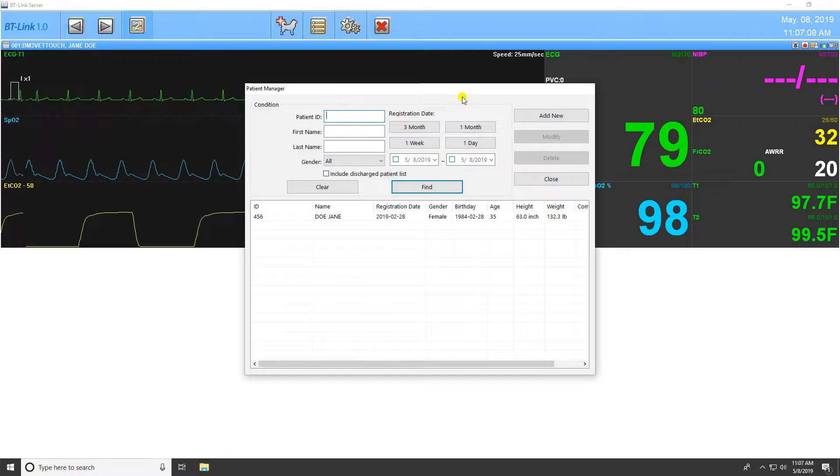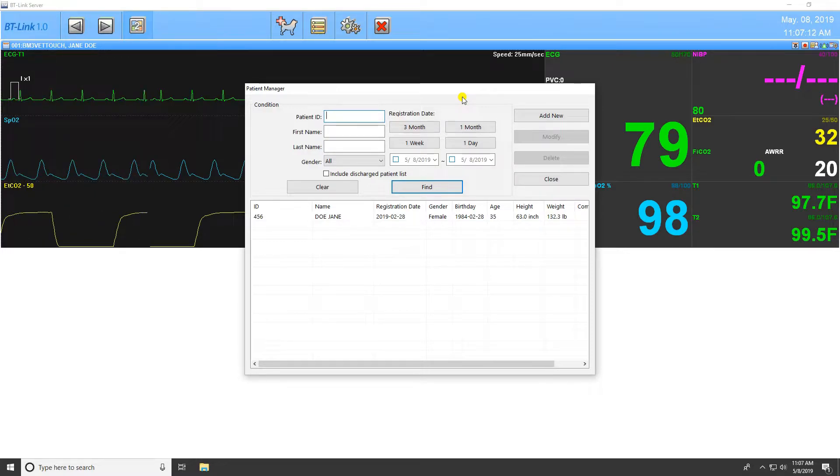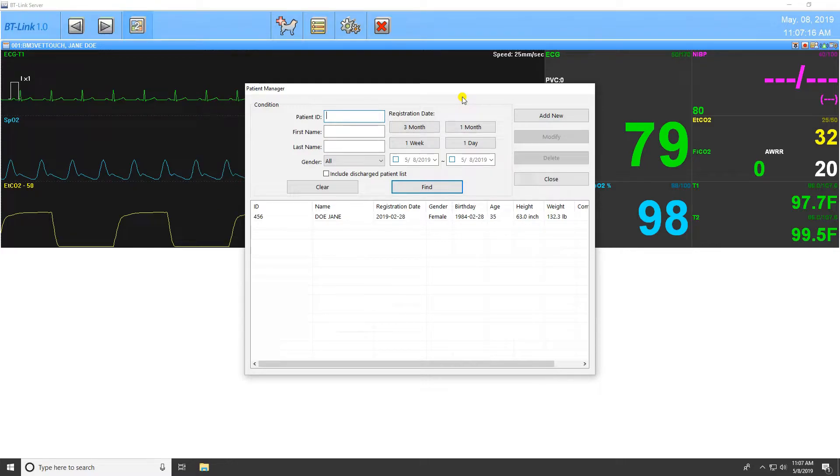From this window, you can search for a specific patient, add new patient information, modify existing patient information, and delete patient information.